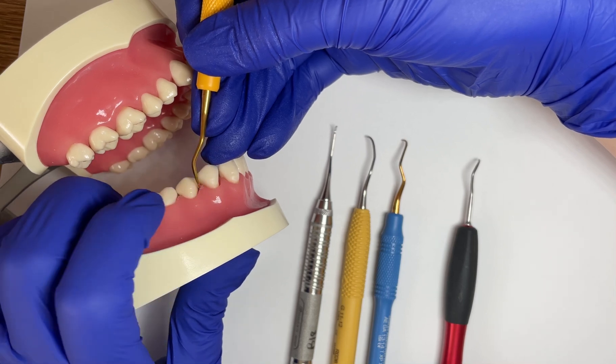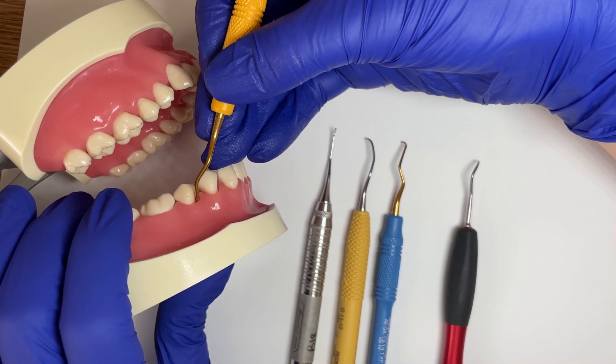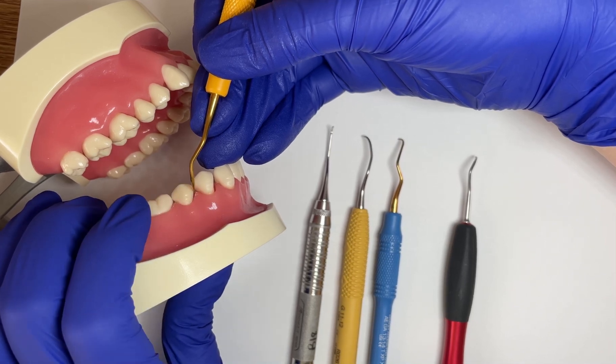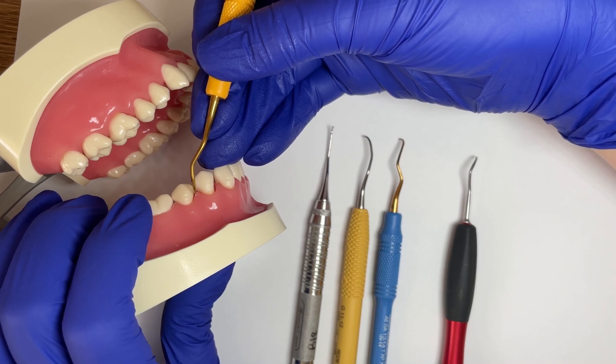Sometimes they make this shank a little bit longer. When they make it longer, that makes the instrument usable for super deep pockets. This one is not an extended shank, but they do make them about three millimeters longer, so we can really access those areas that have a greater amount of clinical attachment loss.